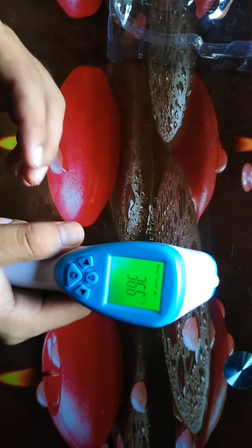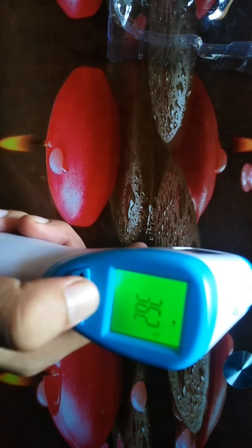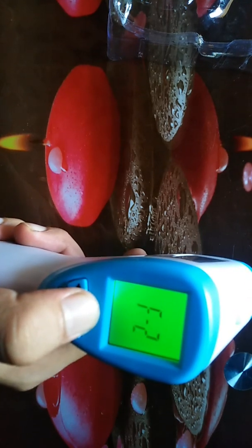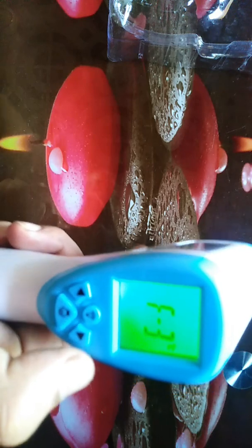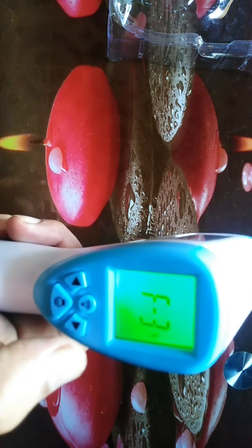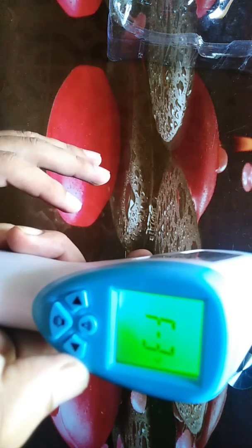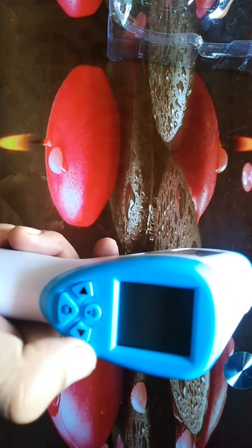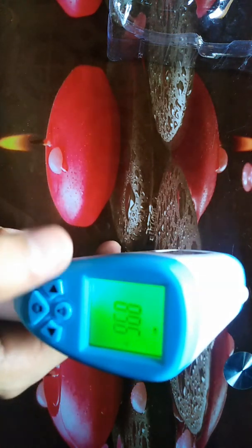To change the unit to Fahrenheit, it is very easy. You press the button once, press it again for F2, and press it a third time — it will show F3. After that, click left or right. Click right, then wait about 60 seconds. After it turns off and you turn it on again, it will show the temperature in Fahrenheit, as you can see here.